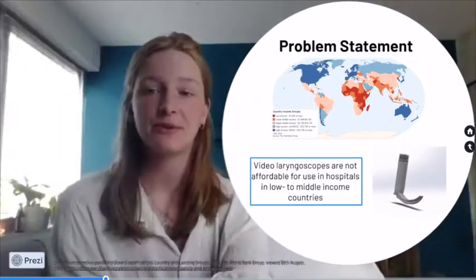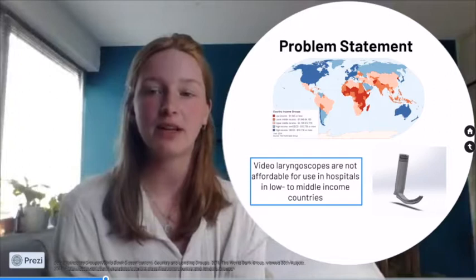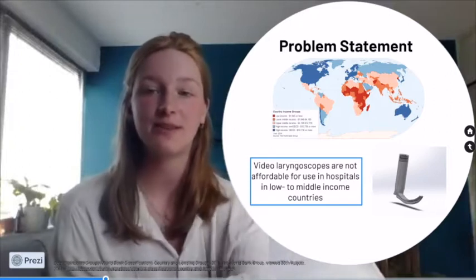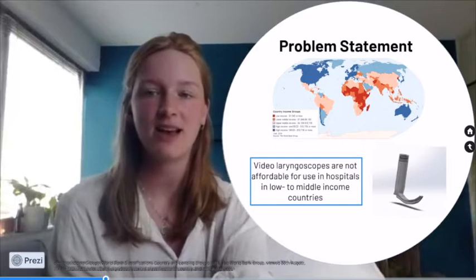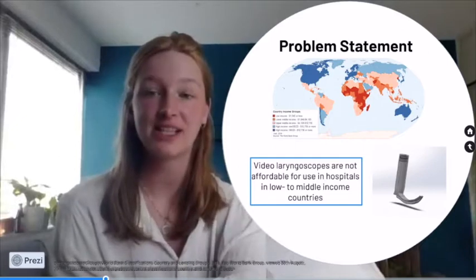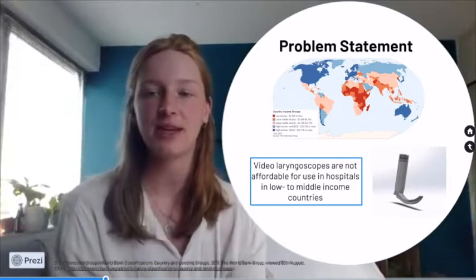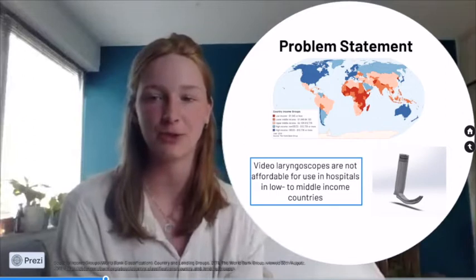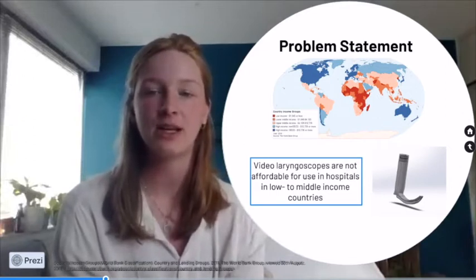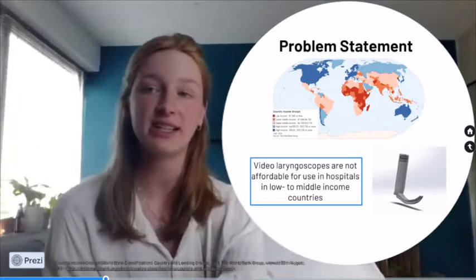The owners of Delscope have developed a video laryngoscope in an affordable manner, which makes it available for low and middle income countries. Their requirements were that it had to be robust, easy to maintain, and easy to clean with as few components as possible. The Delscope connects a low-cost USB endoscope to a smartphone and consists of a 3D printed housing and camera holder, on which a real-time visualization of the airways is displayed. This alternative allows for the advantages of a VL while avoiding its high cost.